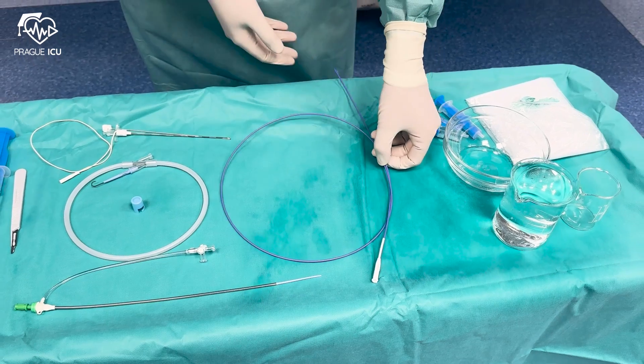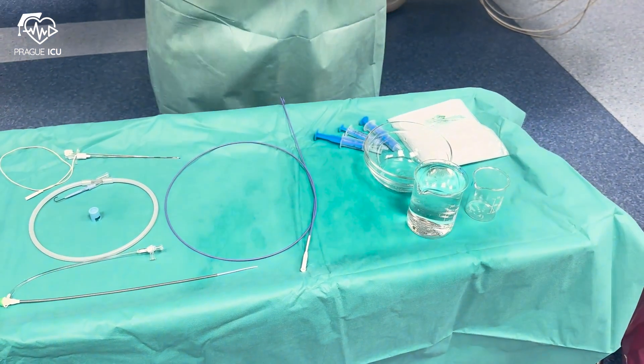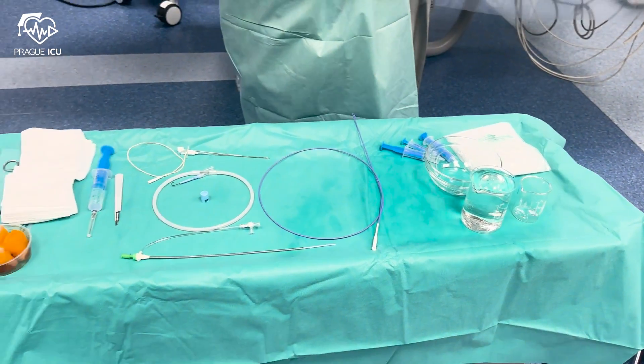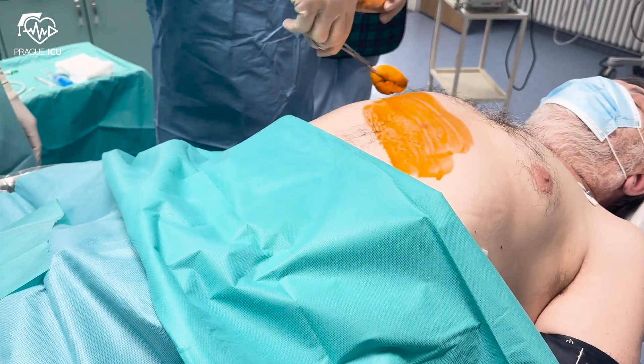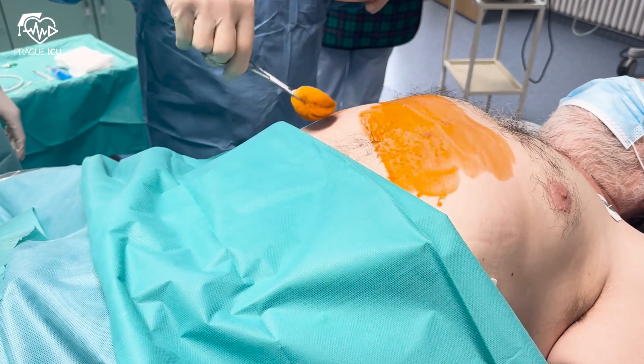We also have a six-French metallic sheath with introducer, a six-French pigtail catheter, saline syringes, and contrast agent. The chosen area is then sterilized using chlorhexidine.